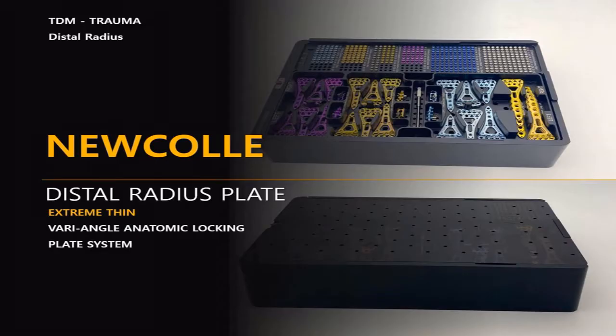Hello everyone, welcome to TDM Korea TV. This is Brian and I work for TDM as an international sales general manager. This video consists of brief information on our new product, NewColle. NewColle, one of our new products in 2020, is a unique optimal solution for one of the common fracture types, distal radius fracture.